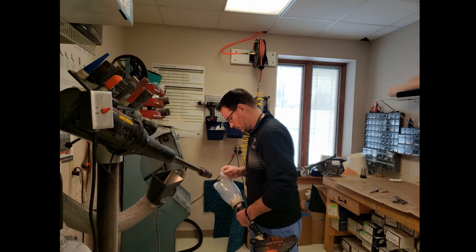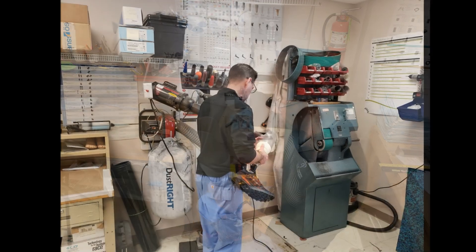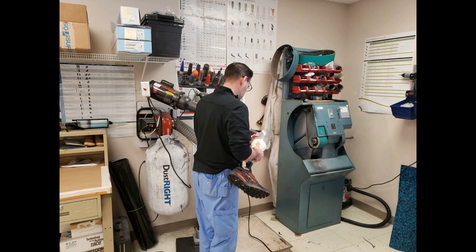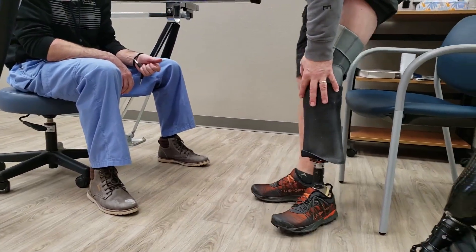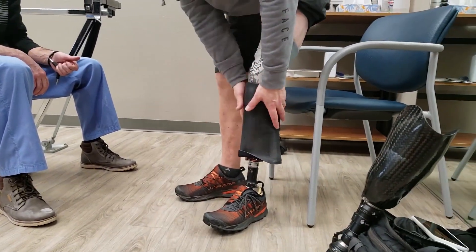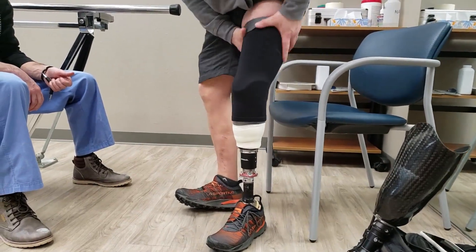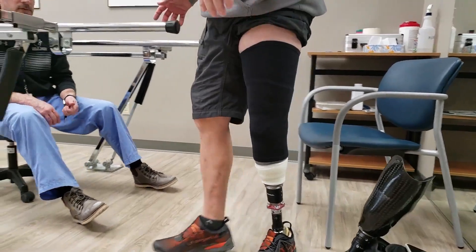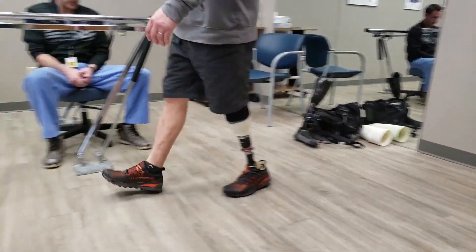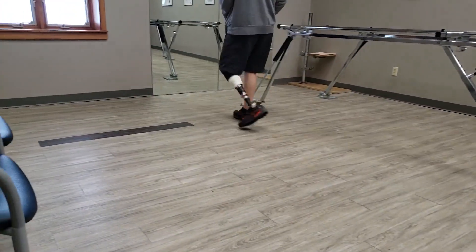While in the lab, the prosthetist has access to specialty tools to feather and further adjust the trim lines and shape of the socket for appropriate fit — a task that is difficult to perform outside the office. Once the adjustments are made, the socket is reinforced and we are ready to apply the whole prosthesis and move forward with gait analysis and patient feedback.